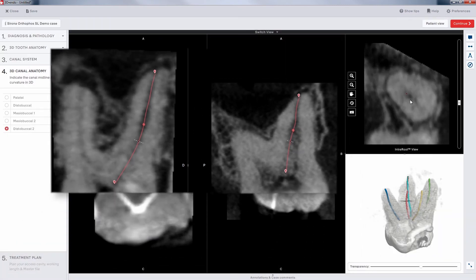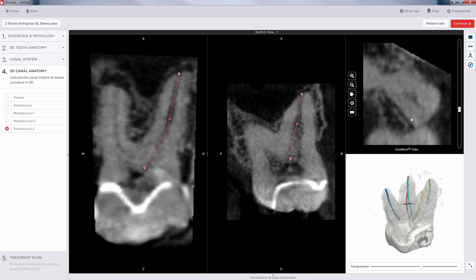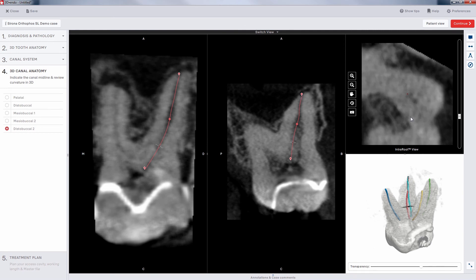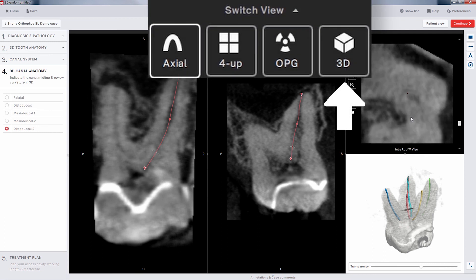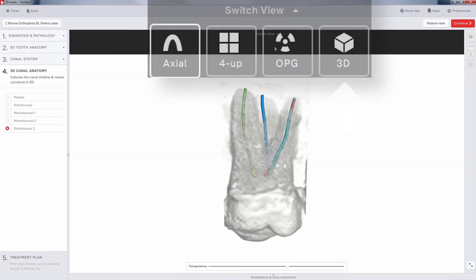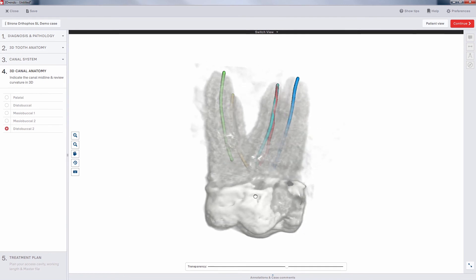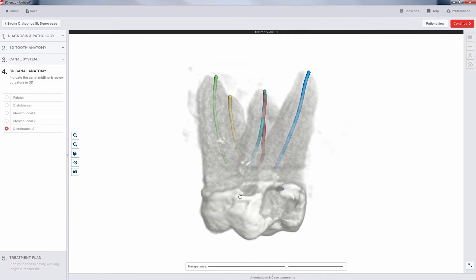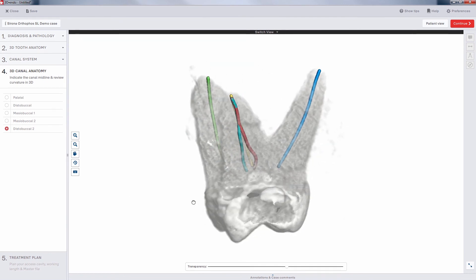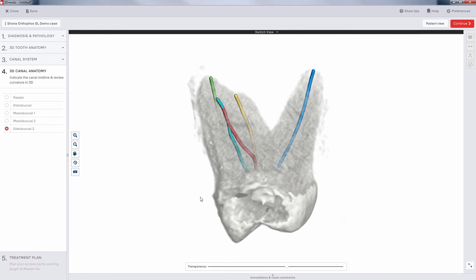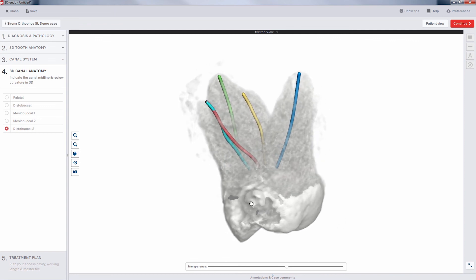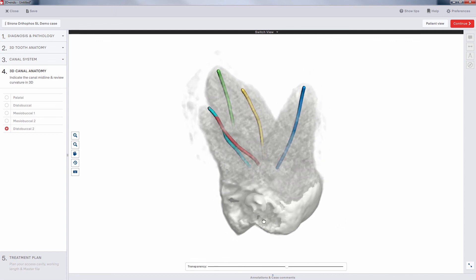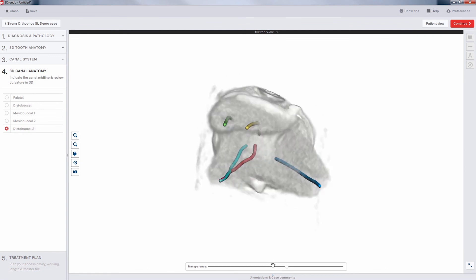Before we click on the Continue button, let's look at the results. Click on the Switch View drop-down at the top of the center window and select 3D. We can rotate this view using the left mouse button, and all of our canal trajectories are color-coded for easy identification. You can clearly see the complexity of this canal network in this example.